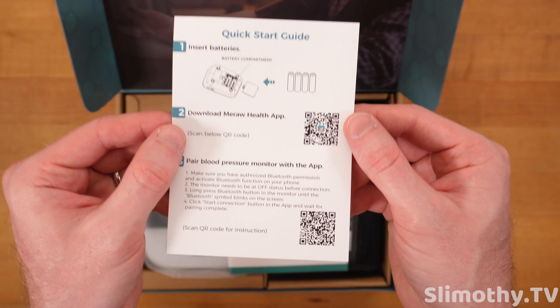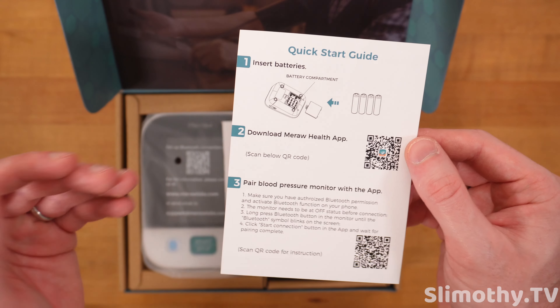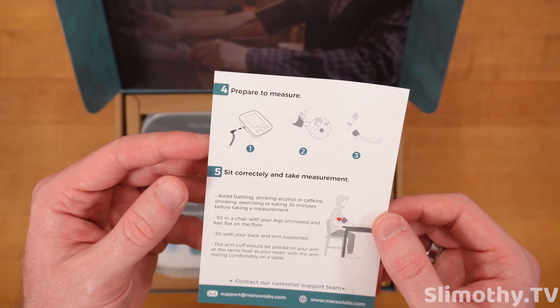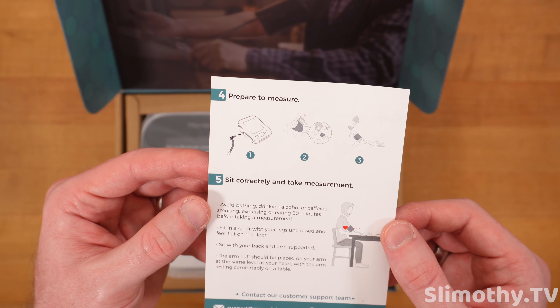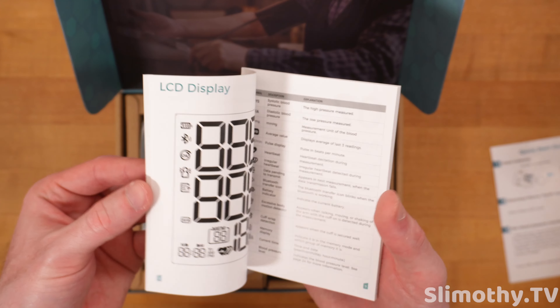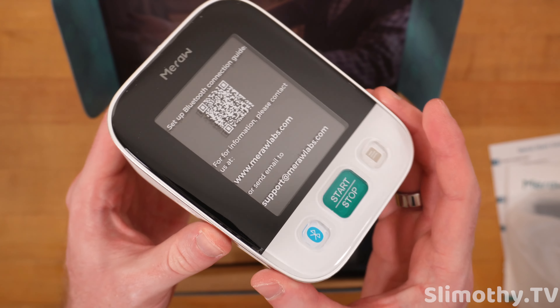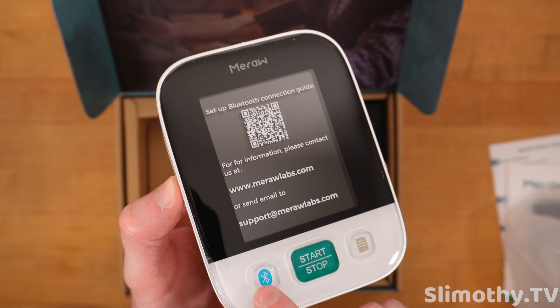We've got a quick start guide — looks very easy: install the batteries, download the app, pair it, prepare to measure, sit correctly. Here is the longer guide in case you need something more in-depth. Here's the main portion of the unit that you'll be interacting with.